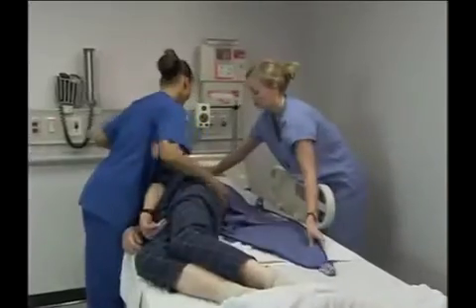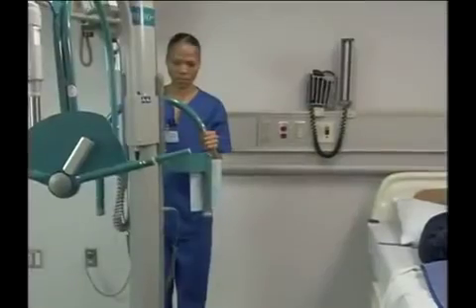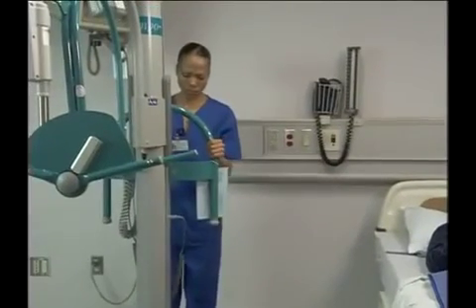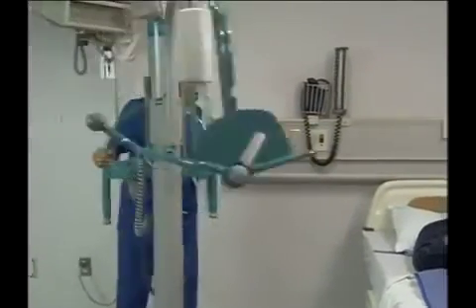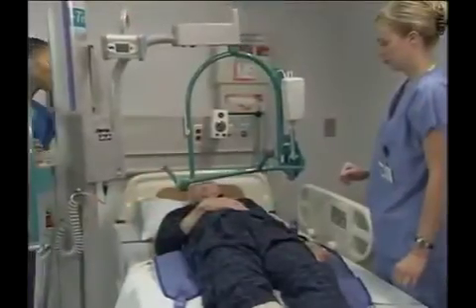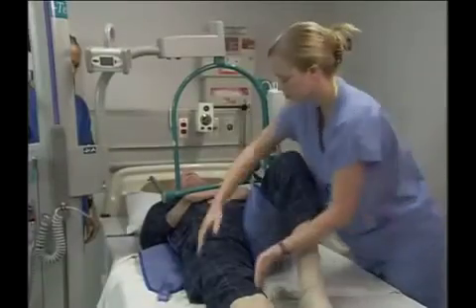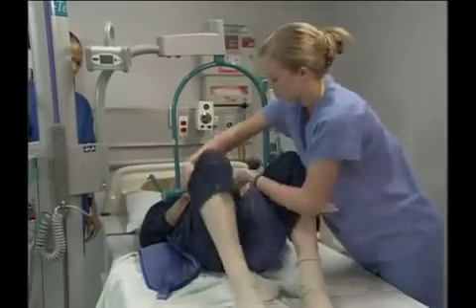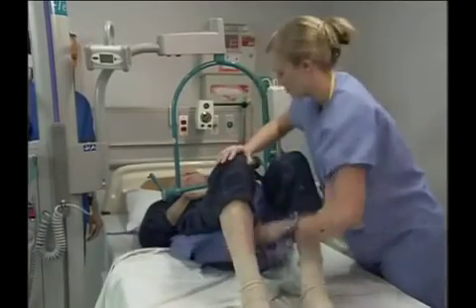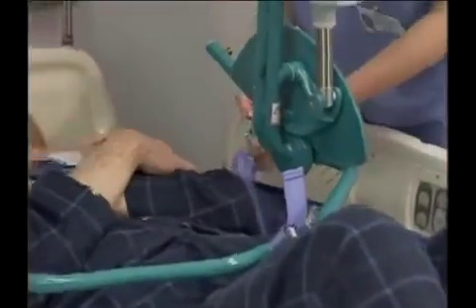The sling's lower edge should be under the person's knees. Raise the lift so it can be moved over the person. Move the lift into position over the person. Then lock the wheels. Attach the sling to the swivel bar. Cross the person's arms across his chest.